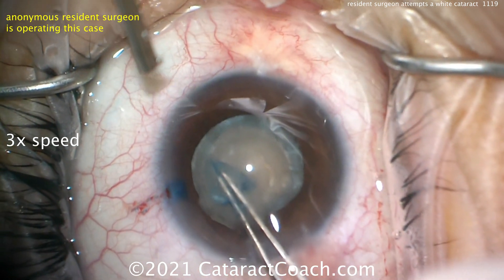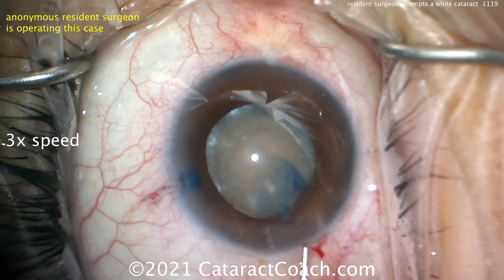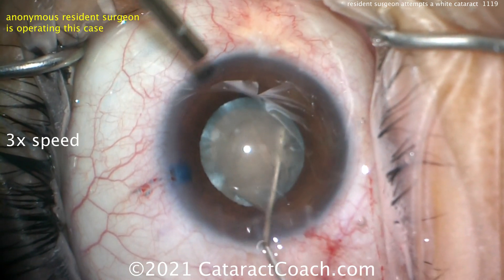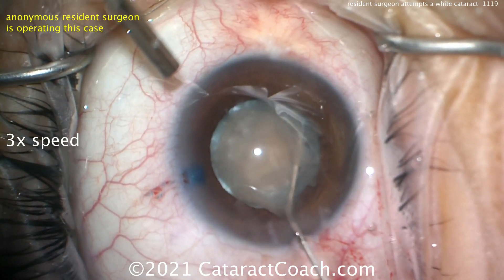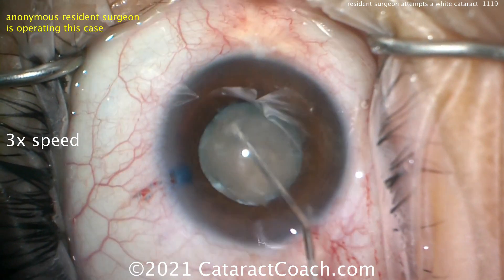You can see that cannula to the top left of your screen — that's his attending. The capsulorhexis is a little on the small side for my flavor, but it's a pretty good-looking capsulotomy. Nice and opaque. Gentle hydrodissection — be very gentle here because the rhexis is a bit small.